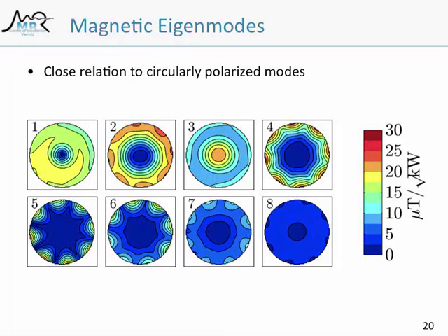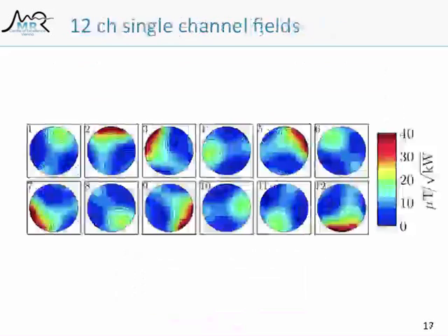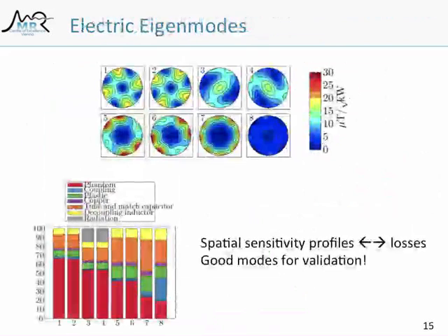And then we have again the sensitivity in the periphery. And again, we saw that before, we've got something like 7 modes that look nice to use. And it's interesting to note this homogeneous mode is basically just the sum of those two.